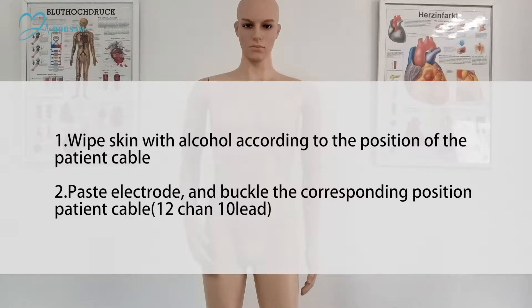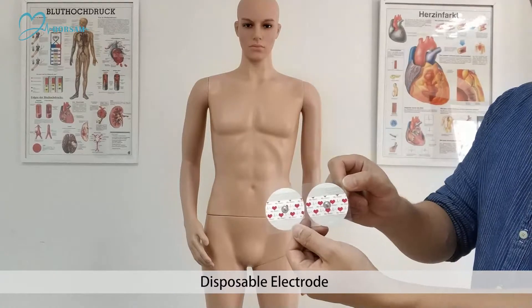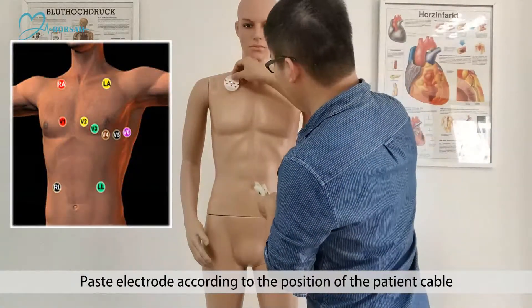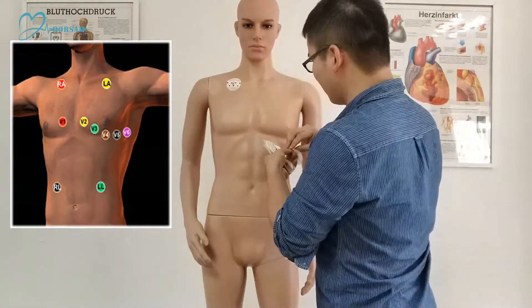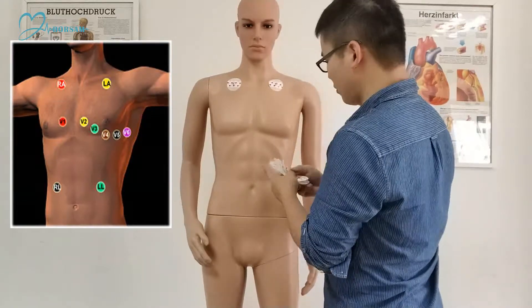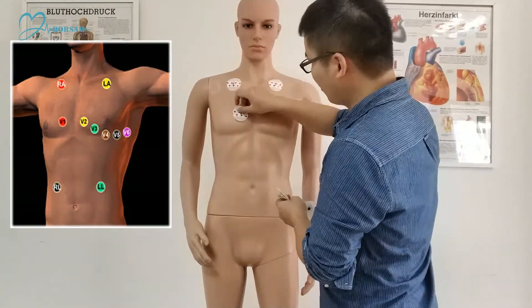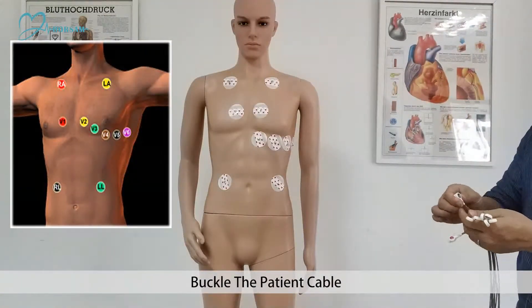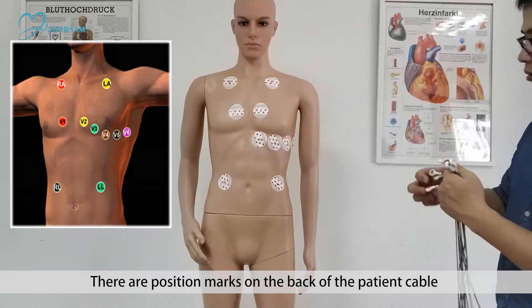Step 2: Paste the electrode and buckle it to the corresponding position on the patient cable. This is a 12-channel, 10-lead setup. Step 3: Use disposable electrodes. Step 4: Paste electrodes according to the position of the patient cable. Step 5: Buckle the patient cable.